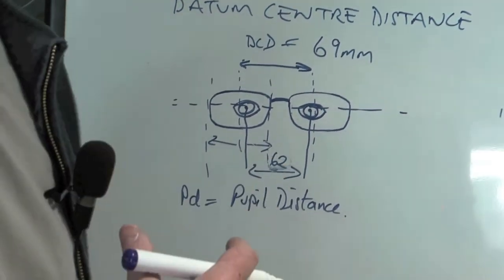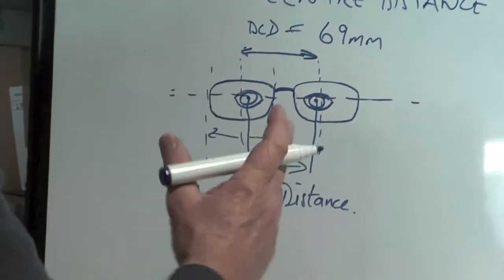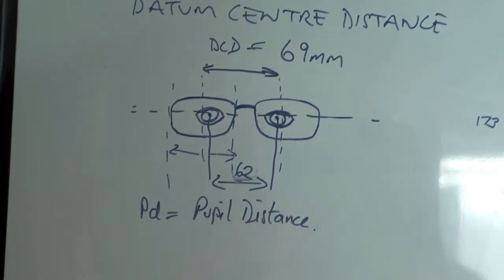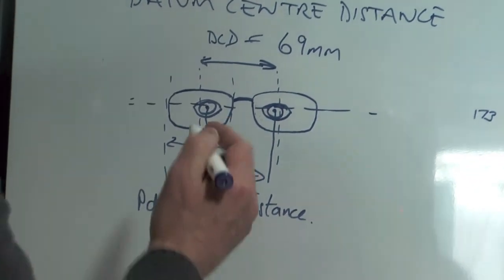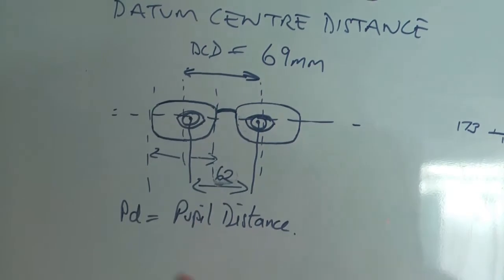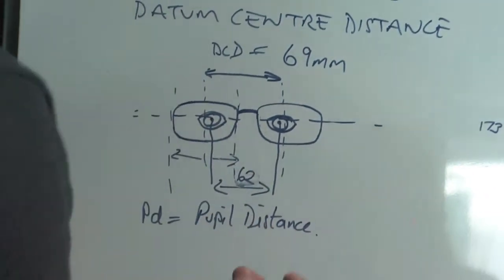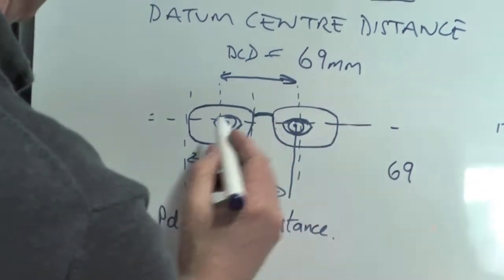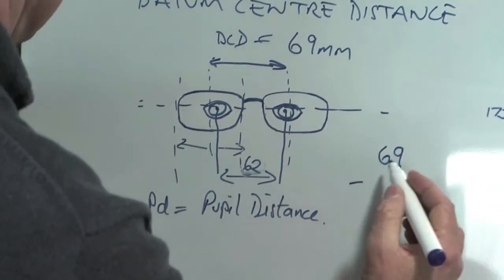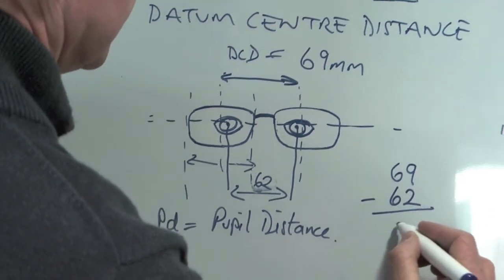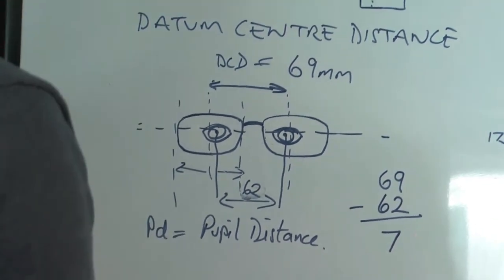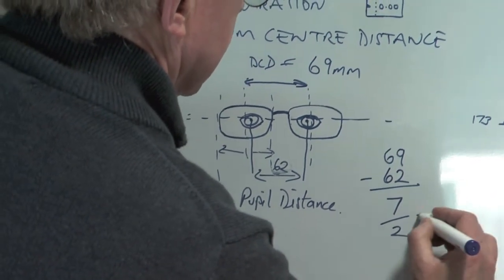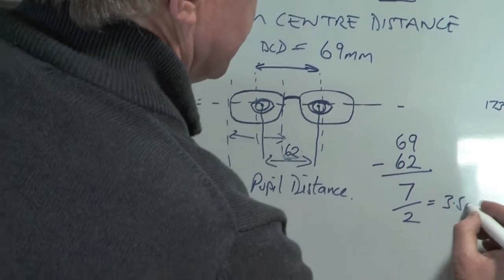So there is a difference. So we need to de-center the lenses in the right and the left eye to make it 62 millimeters. We can't just cut the lenses so they fit in the middle because they'll be too wide. So to do that we need to take the DCD, which is 69, and then we subtract the PD, which is 62, which equals seven. And then we divide that by two. And that equals three and a half millimeters.